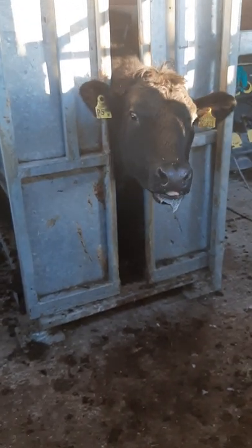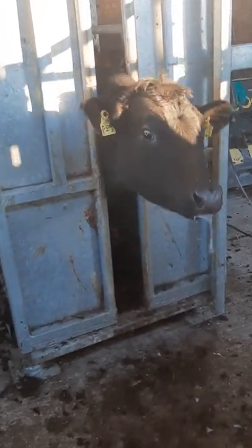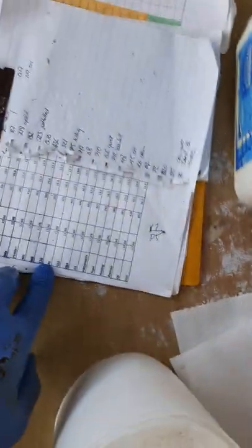Right then. CIDR sink. Animal correctly restrained. Check the tag number. Check my paperwork.